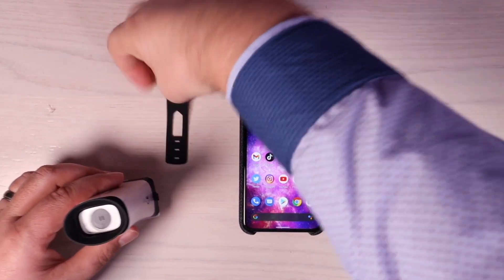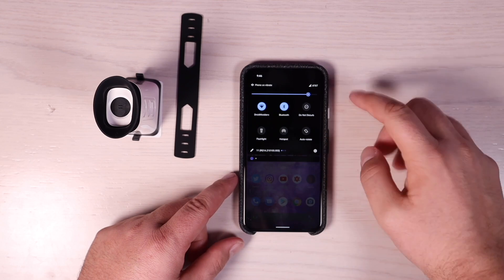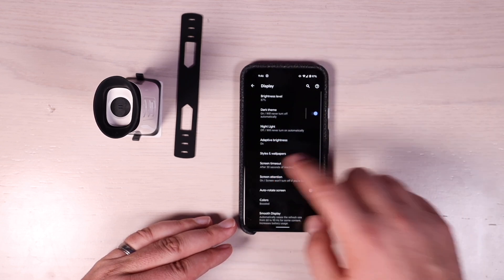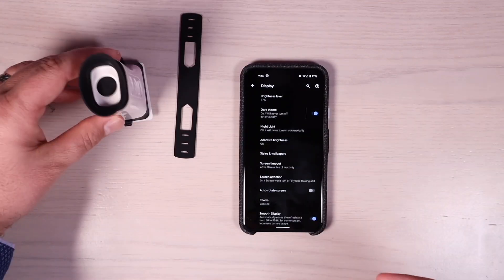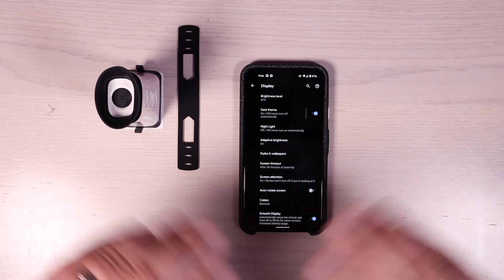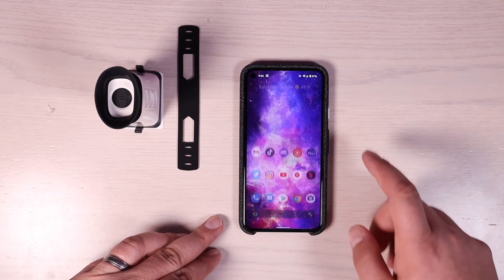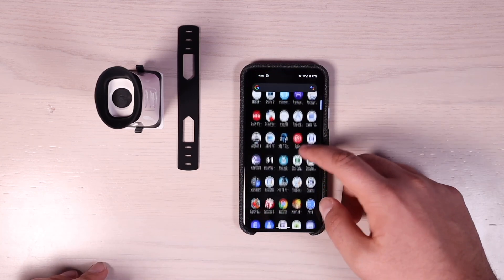One thing I would recommend: go into your settings and turn your display screen timeout to 30 minutes. It's only going to take about five minutes, or no more than 15 minutes, to do all of your tests. What's really going to be annoying is if you're in the middle of the test and your display turns off, so always make sure to maximize your screen timeout. Then go ahead and open the IQ application.